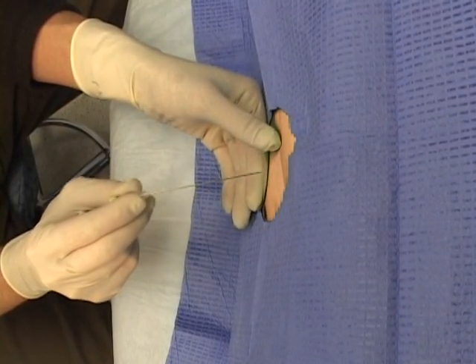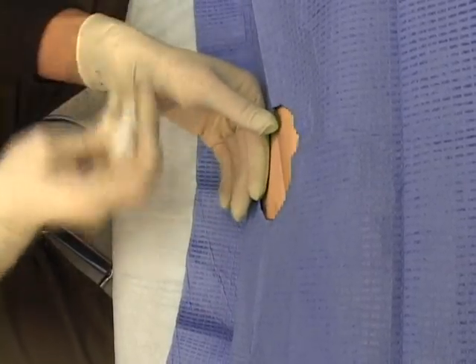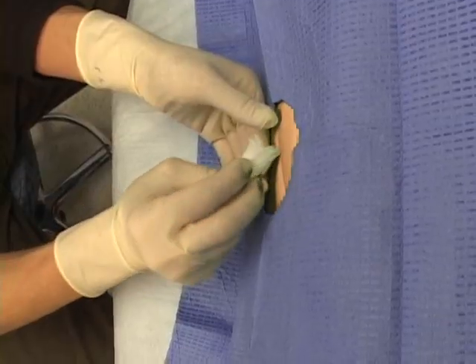After the collection of fluid is complete, replace the obturator and remove the needle. The procedure is now complete.